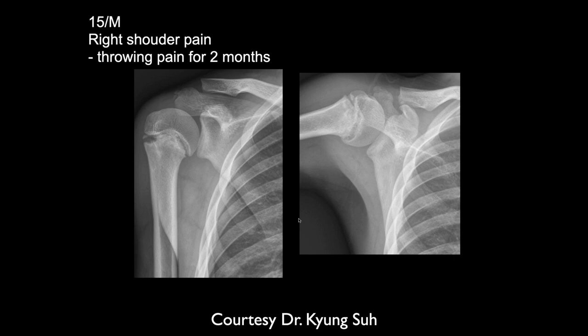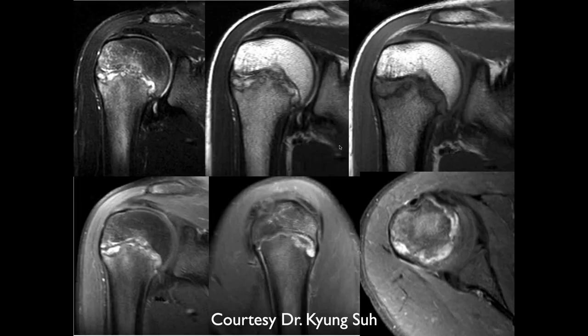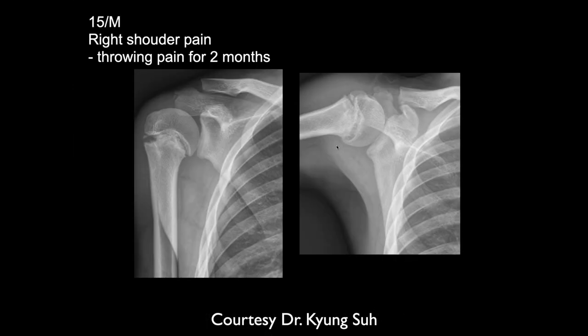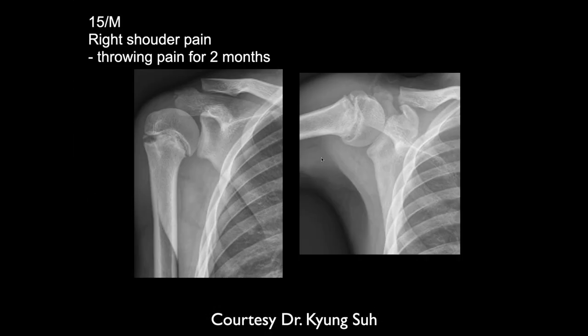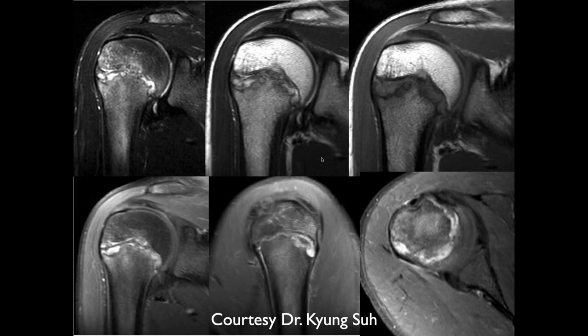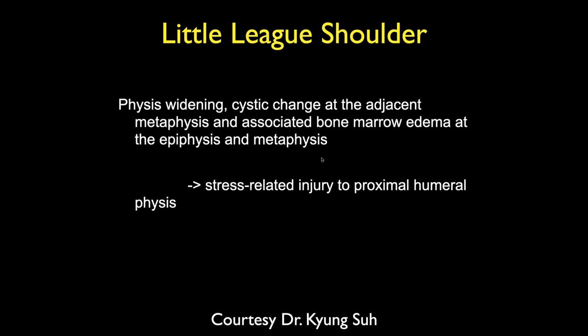This is a 15-year-old male with right shoulder pain and throwing pain for two months. There is diastasis at the growth plate, some fragmentation and irregularity, and also some displacement — it's in varus with some rotation. On MR there's quite a bit of fluid and separation.